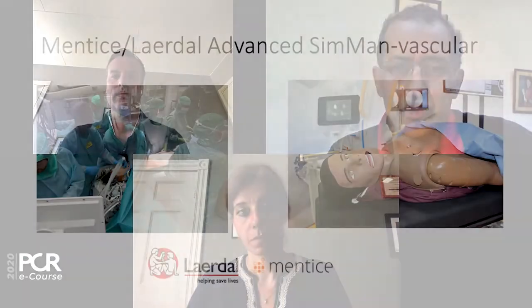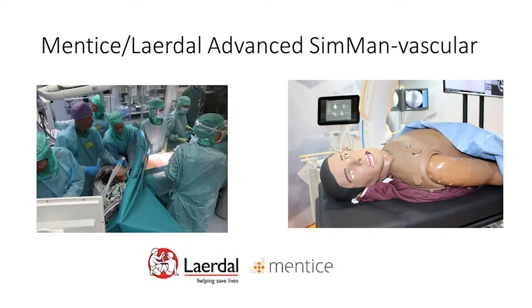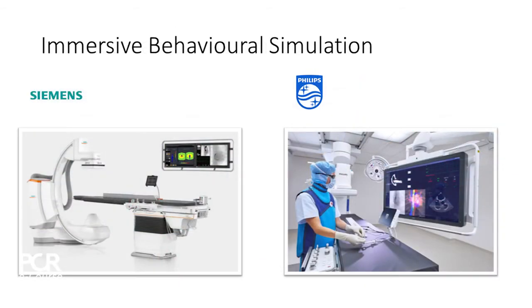The lateral mannequin, which has been developed by Mentis, can be placed onto a Siemens or a Philips cath lab table, and then the case is treated pretty much as a normal case. Let's imagine vascular access has been achieved, and then the whole case runs pretty much as normal thereafter, including defibrillation on the mannequin if required.